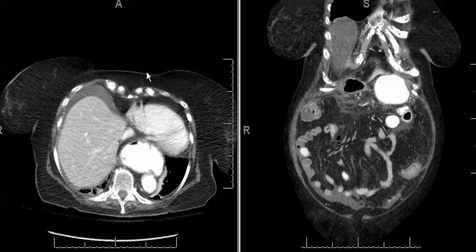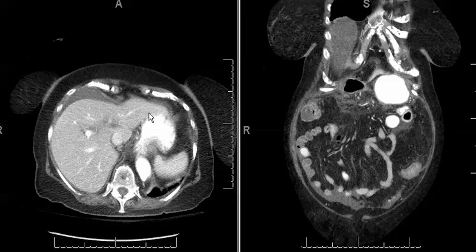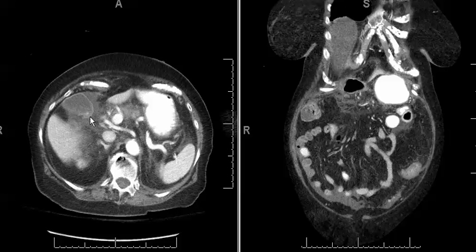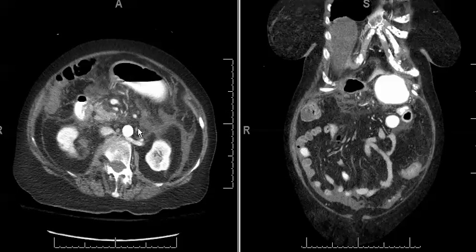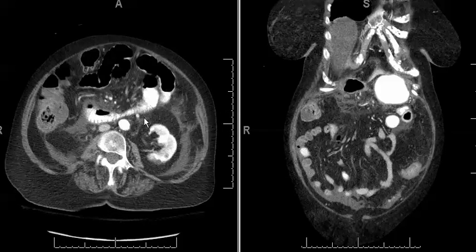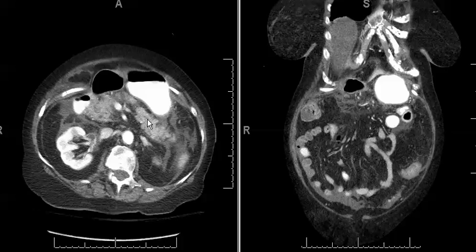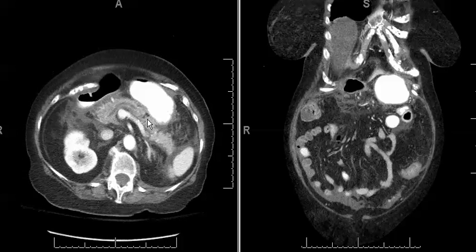As we scroll through the axial sequence we already notice peri-hepatic fluid. There's a gallstone layering here in the gallbladder with pericholecystic fluid and edema. However, if we continue to scroll we notice that most of the edema is centered around the pancreas and the pancreas is enlarged.